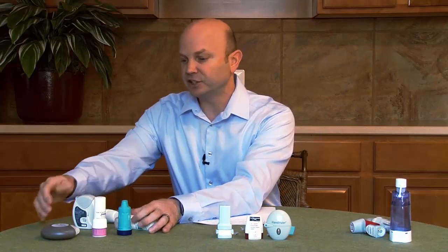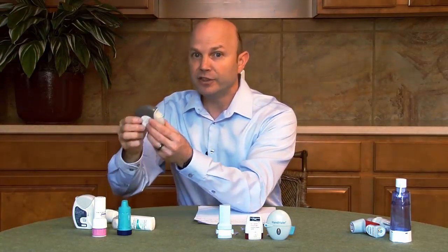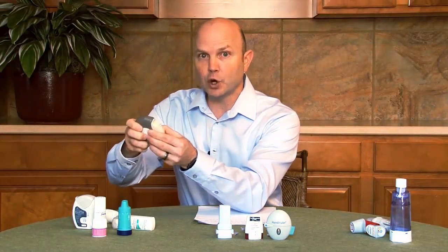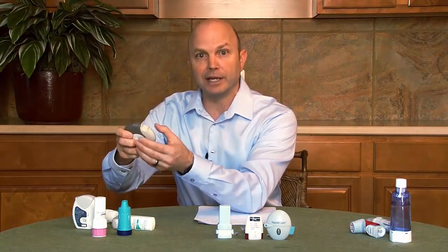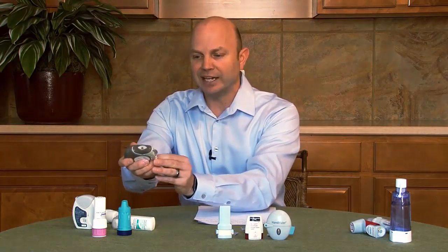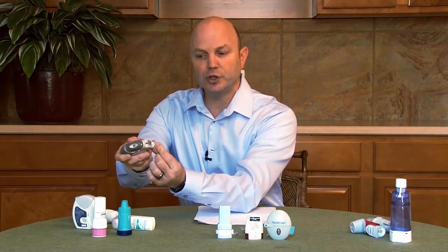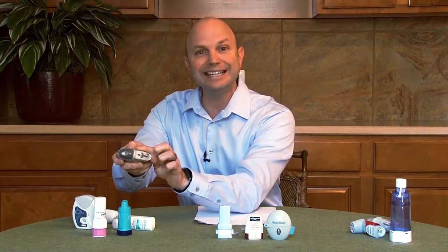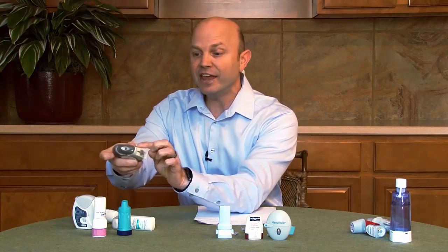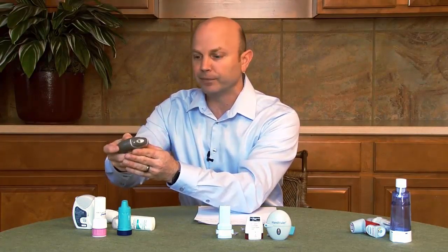The other thing about these devices is some of them have rather tricky mechanisms to load that medicine. These are not toys, so please don't play with or try to inspect them. It's really important to read the manufacturer's instructions. For this device, you can open and close the cover as much as you want. But as soon as you press this trigger, you release that medication, and then it's going to be inside the mouthpiece, and if you blow or dislodge it, that medicine will go away.